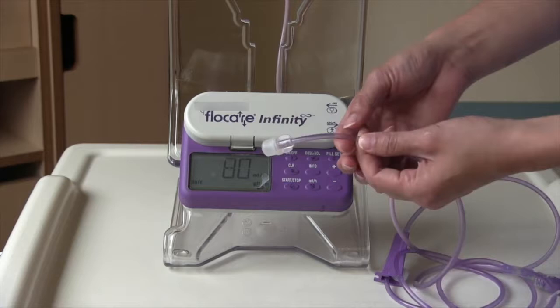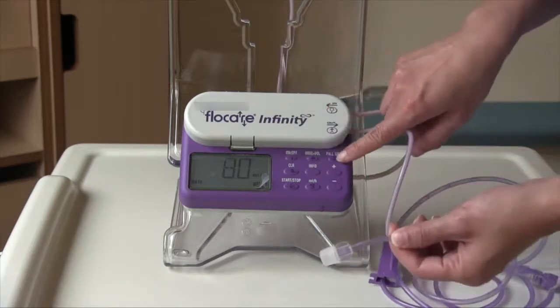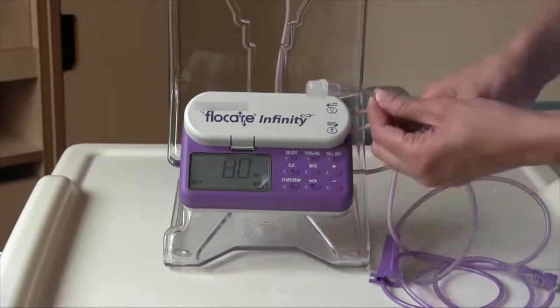If you notice that the feed is going right up until the end and it's not stopped, you can press the fill set button again to stop the fill.